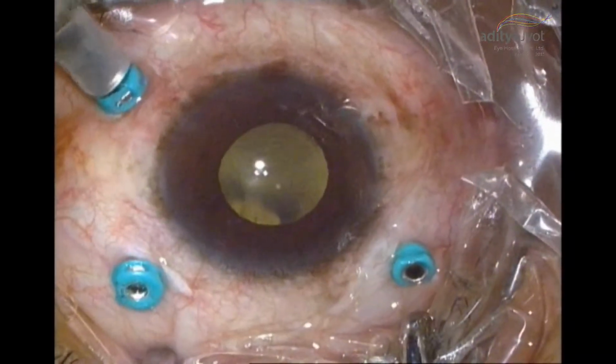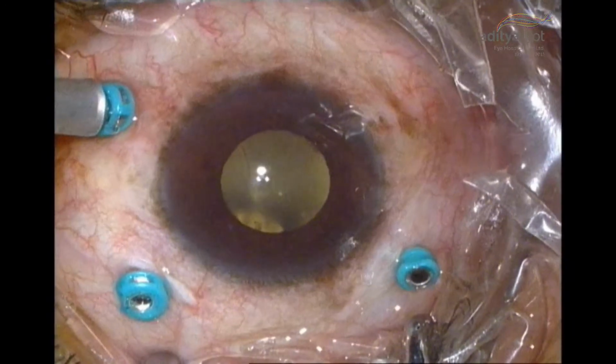So now you are seeing on the screen the 3 ports being made, and after that I am now using the 3D, and it's like watching a 70 mm screen and sitting and operating, and that's what I am doing now. And this is the case of proliferative diabetic retinopathy with traction on the macula.